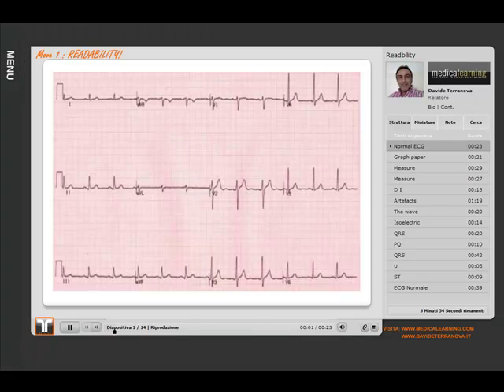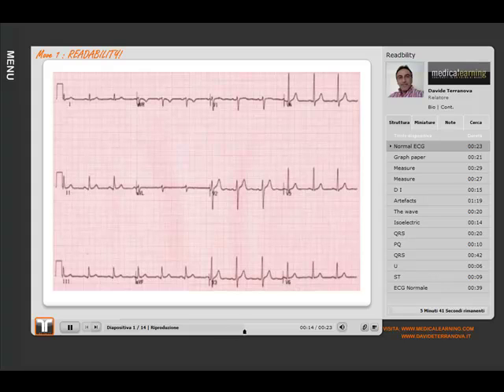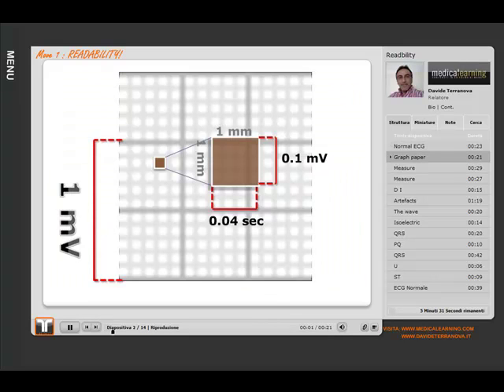First lesson on readability. If you have applied the electrodes in the proper way, the first electrocardiography graph should have come out like this. The ECG will be printed on a graph paper that we use in order to be able to carry out the necessary measurements. You must be aware that the smallest square of the paper is one millimeter by one millimeter.